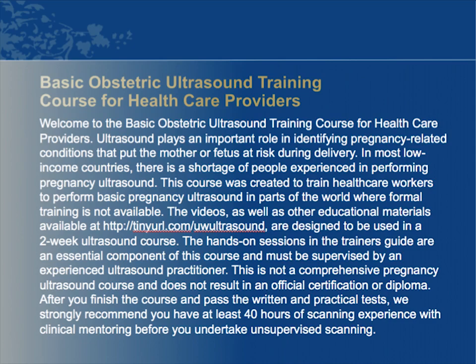The videos, as well as other educational materials, available at tinyurl.com/UWultrasound, are designed to be used in a 2-week ultrasound course. The hands-on sessions in the trainer's guide are an essential component of this course and must be supervised by an experienced ultrasound practitioner. This is not a comprehensive pregnancy ultrasound course and does not result in an official certification or diploma. After you finish the course and pass the written and practical tests, we strongly recommend you have at least 40 hours of scanning experience with clinical mentoring before you undertake unsupervised scanning.